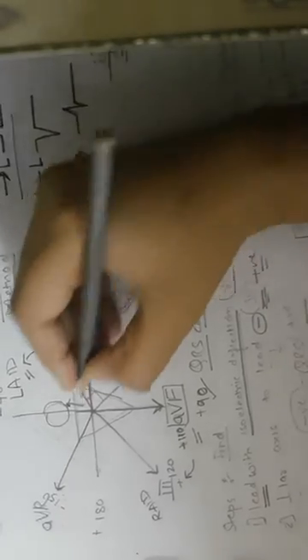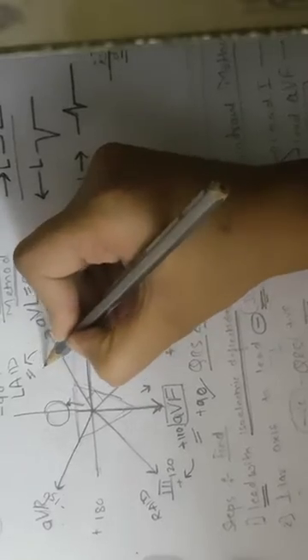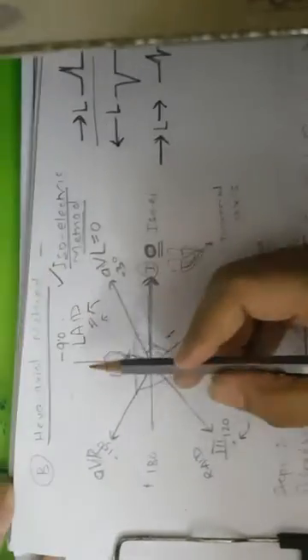If lead 2 is showing a negative QRS complex, then the current is flowing in the opposite direction, which means there is left axis deviation. This is how you find the cardiac dipole by the hexa-axial method. This is an approximate method; here you cannot find an accurate angle.